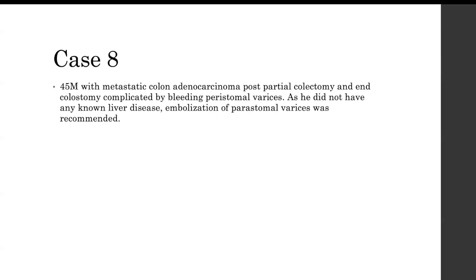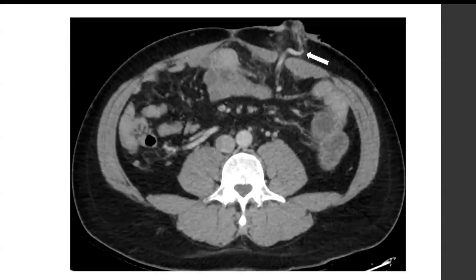So this is another manifestation of a very similar thing to the last case, where you have bleeding rectal varices. Here you can still think of it as being rectal varices, but it's an artificial rectum. So the blood flow, instead of being reversed in the vein supplying the rectum, is reversed in the vein supplying the stoma. And so this was a CT. You see this large vein that normally would be draining the stoma, but actually the flow is backwards, so it's going out into the stoma.